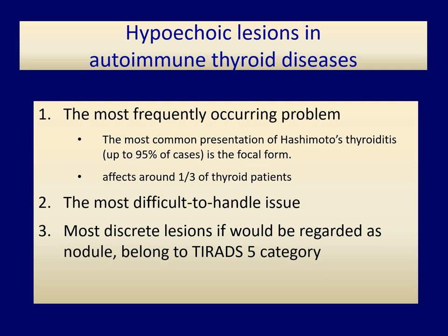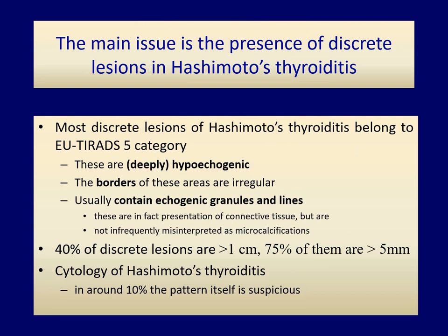It is most common here that we cannot determine whether a lesion is a real nodule or not. Most discrete lesions seen in autoimmune thyroiditis would be TIRADS V rated if considered as nodules. Due to the infiltrative nature of thyroiditis, a discrete lesion is characterized by irregular shape and borders, similarly to papillary cancer. Moreover, many foci of thyroiditis have intranodular echogenic lines and granules which, although presentations of connective tissue, can be misinterpreted as microcalcifications. Although most foci of thyroiditis tend to be small, a significant proportion are larger than 10 mm. And aspiration cytology is less reliable in oxyphilic lesions and not infrequently results in suspicion of Hürthle cell tumor — that is, a false positive diagnosis.